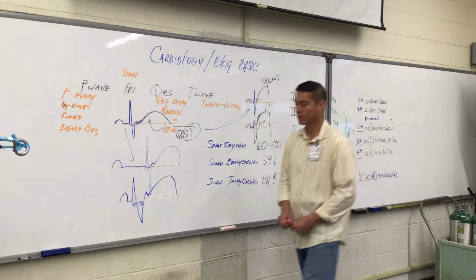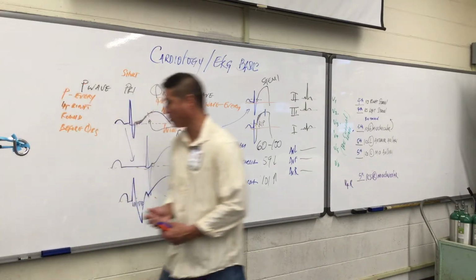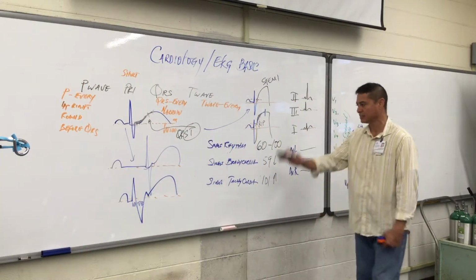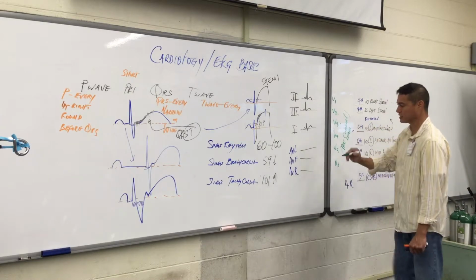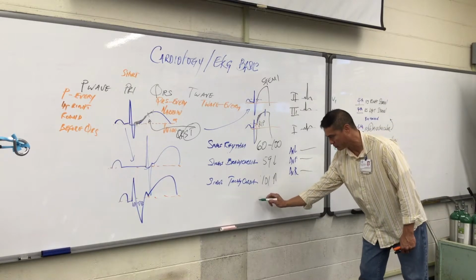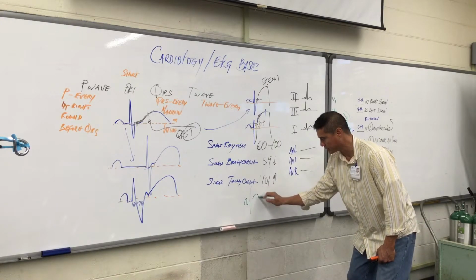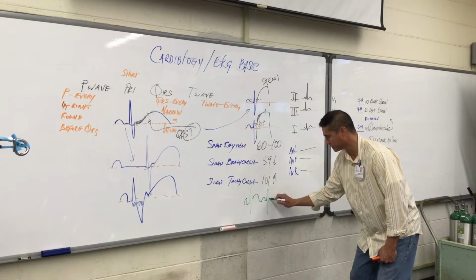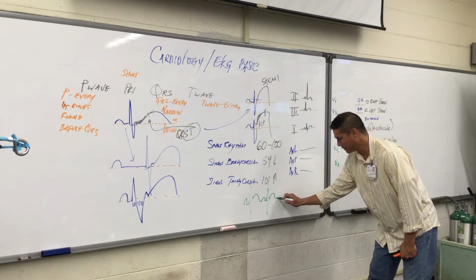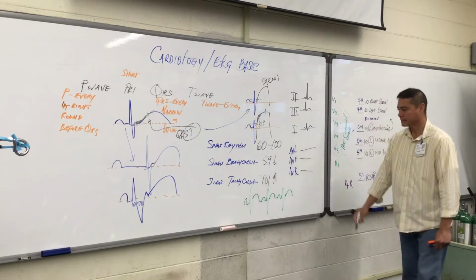Okay, there is just one small little caveat I'd like to throw in so that you guys are aware of. When we start to see these strips go across and you see the EKG transition all the way across, I believe you'll be able to see this. We've got a P wave, QRS, a T wave, P wave, QRS, a T wave, P wave, QRS, and then a T wave.